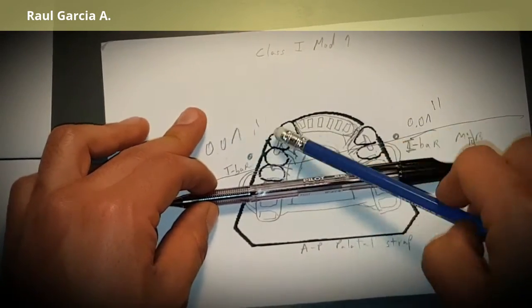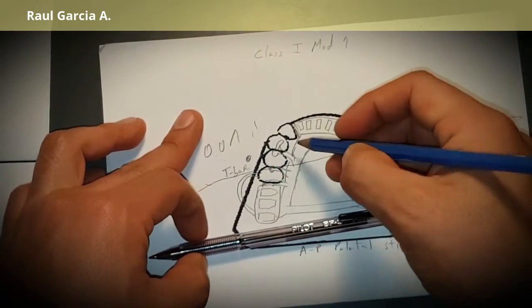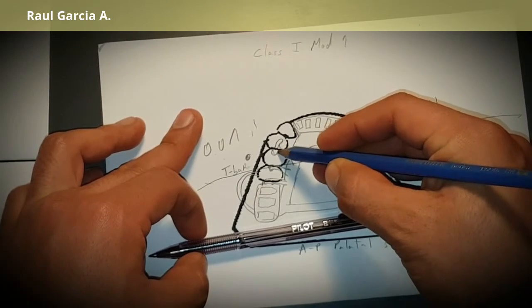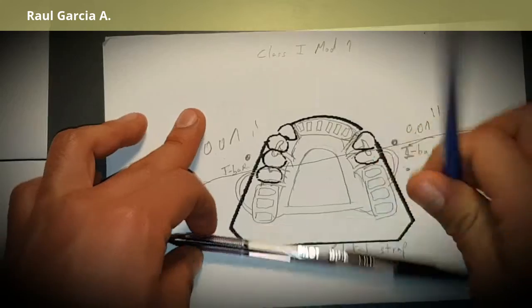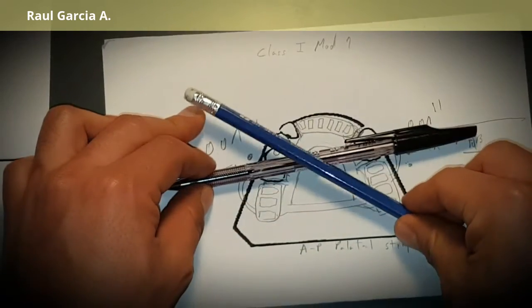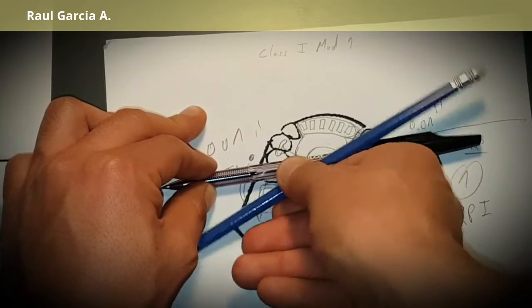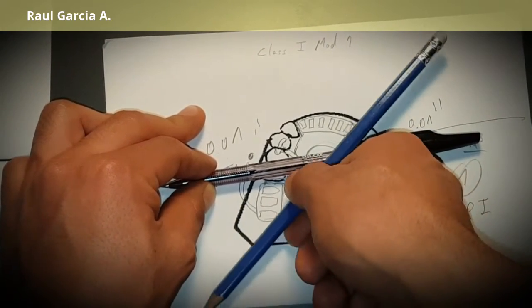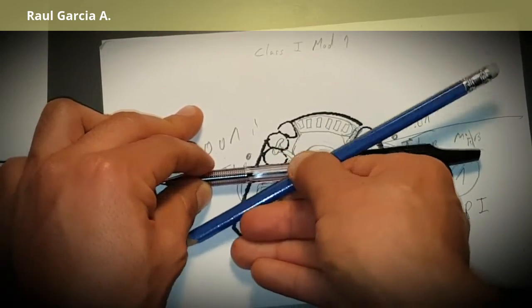A canine is a good abutment for indirect retention, but a premolar is even better, especially with a long free-end saddle. In this case, I place two rests: one in the cingulum of the canine and one in the mesial fossa of the premolar. This covers one side of the saddle.